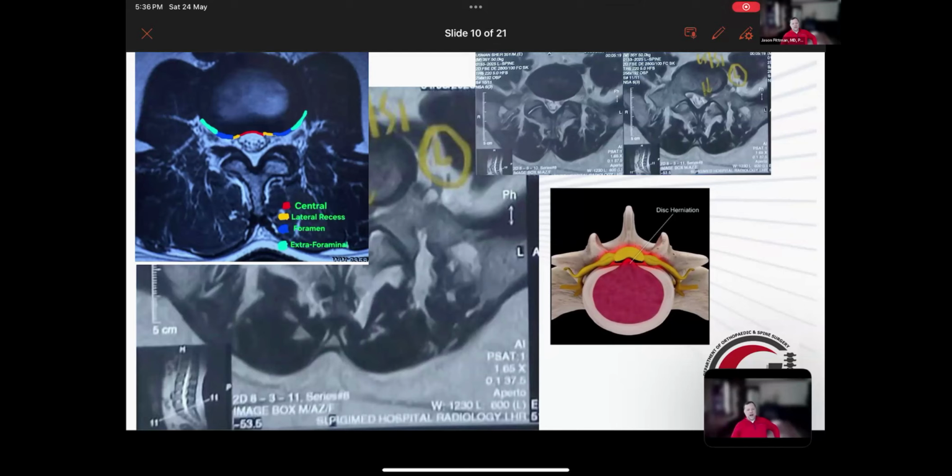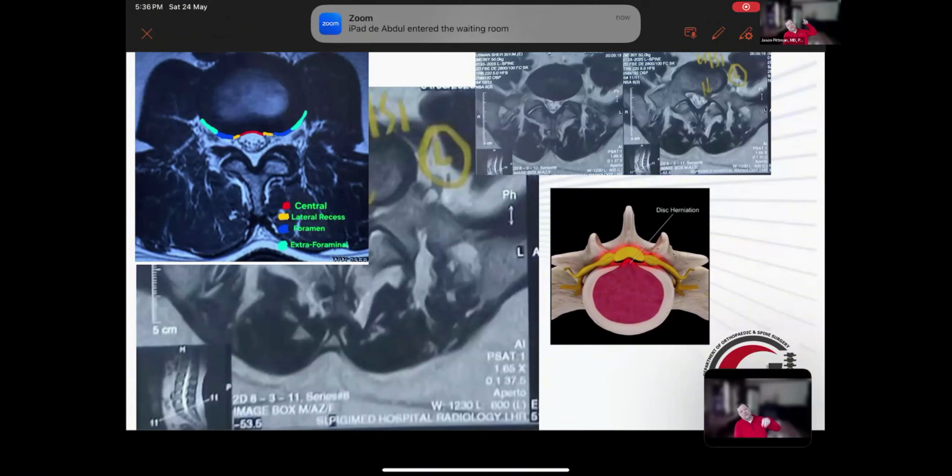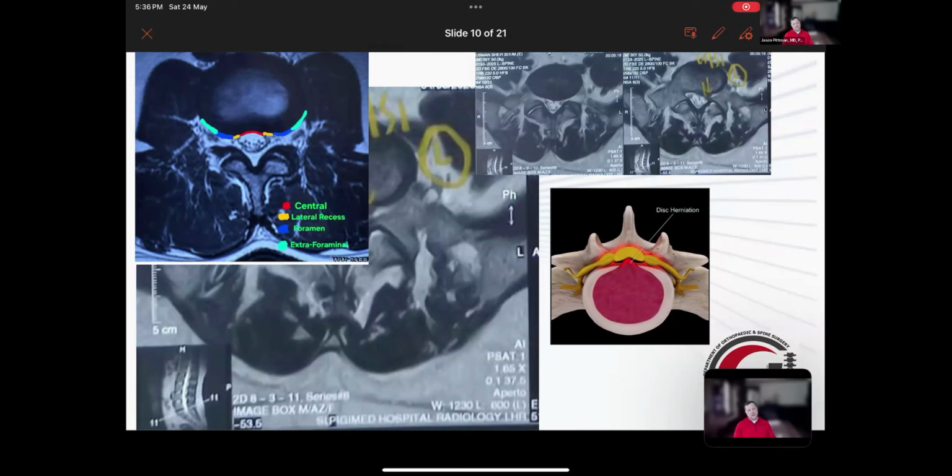And with biportal, it's easy to place a drain because you have the two portals. So you can leave the camera in place and see that you're placing the drain where you think you are. Uniportal, you don't have that luxury necessarily, and you're trying to put the drain down the working portal and then pull the camera and the cannula and the scope out with the drain still in place. And so it becomes a little bit of a disaster.